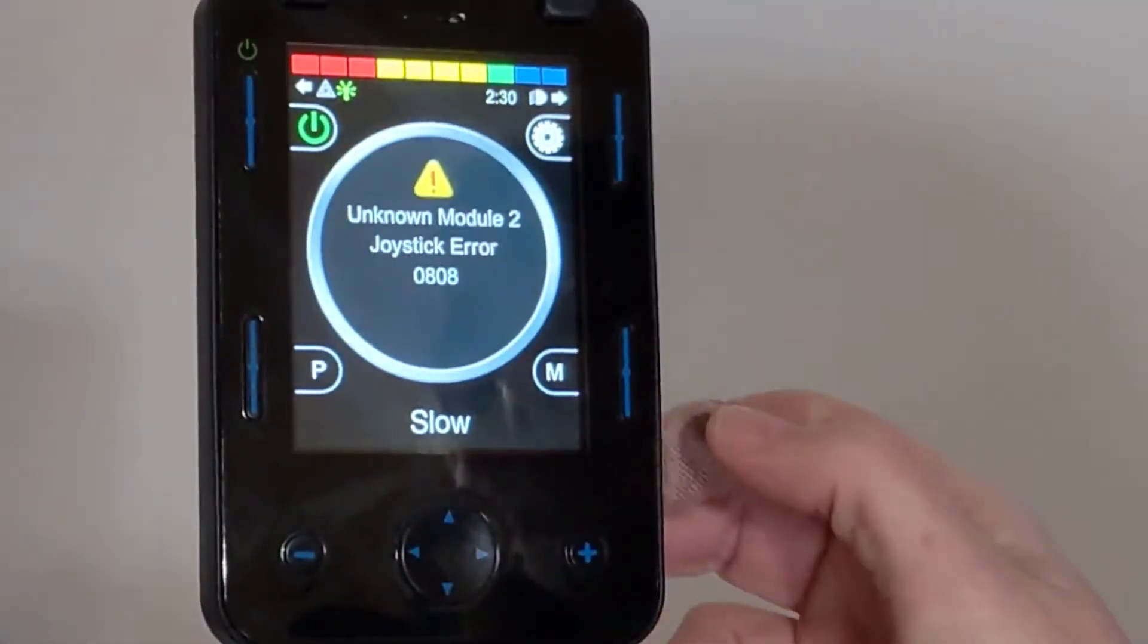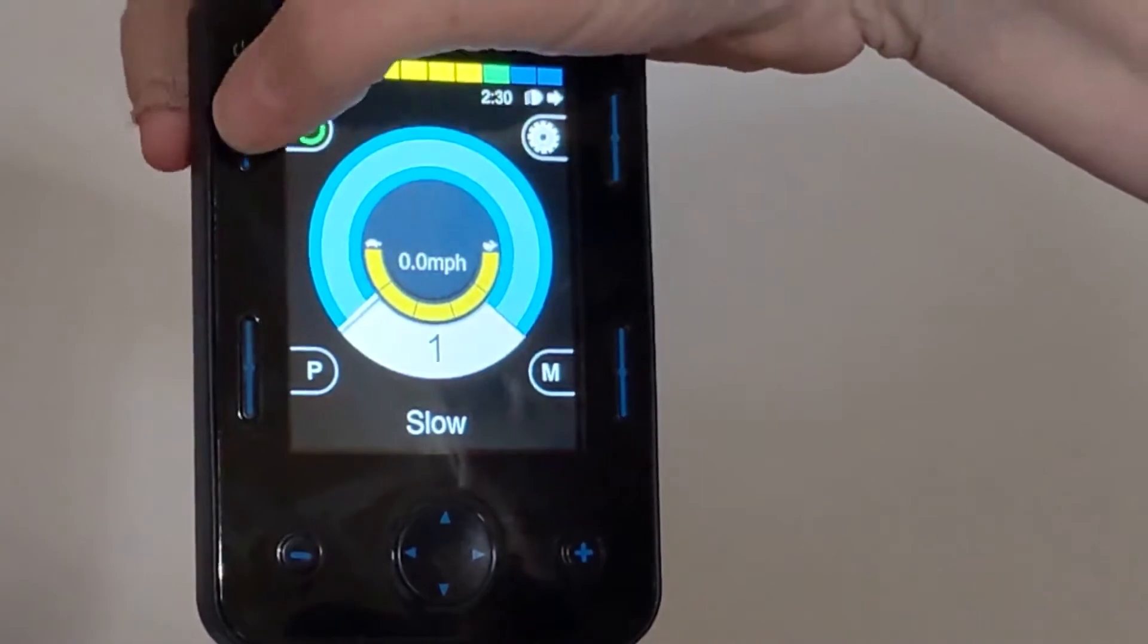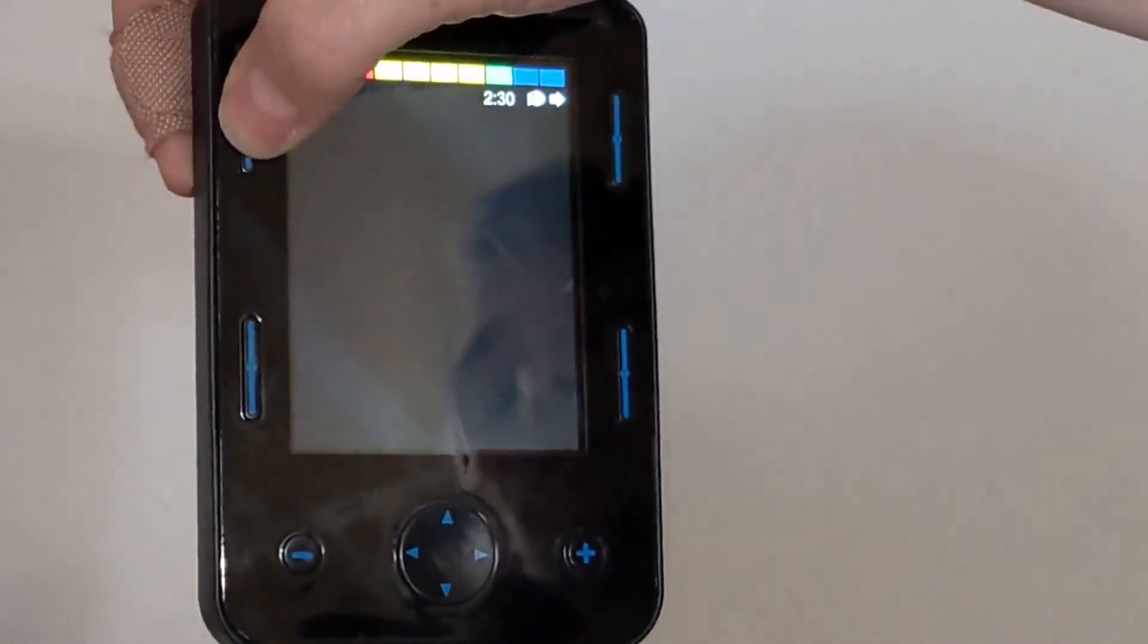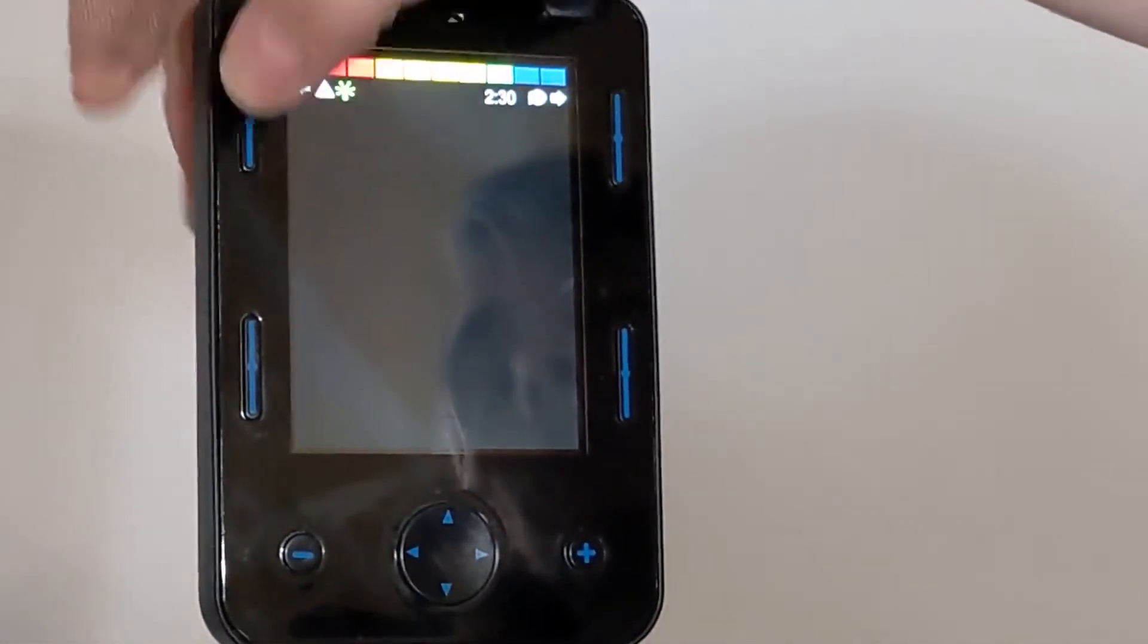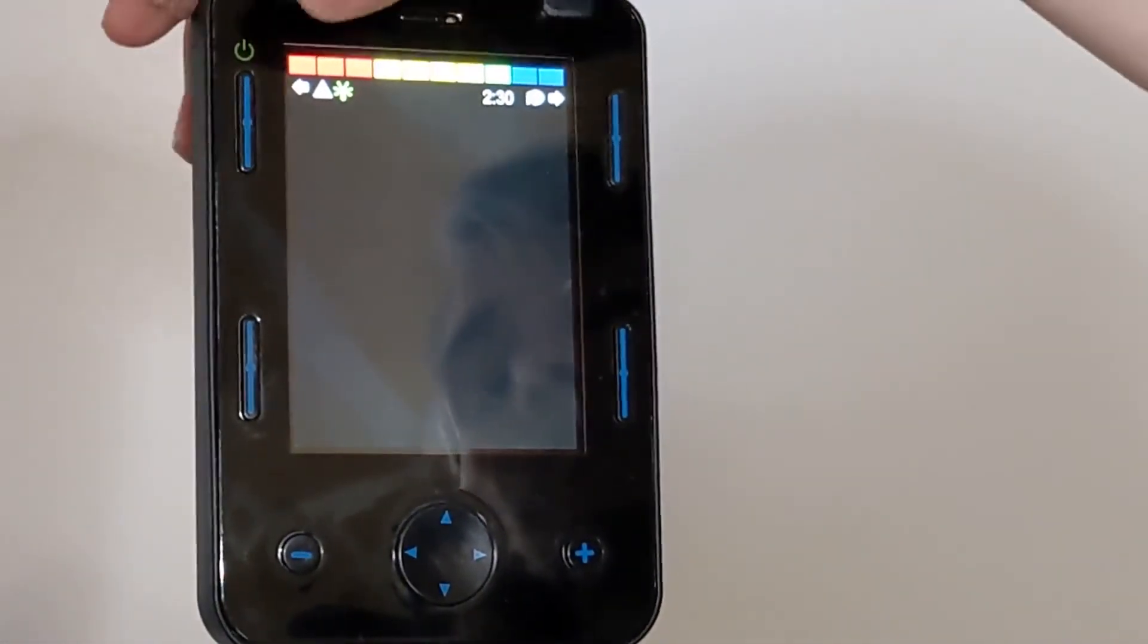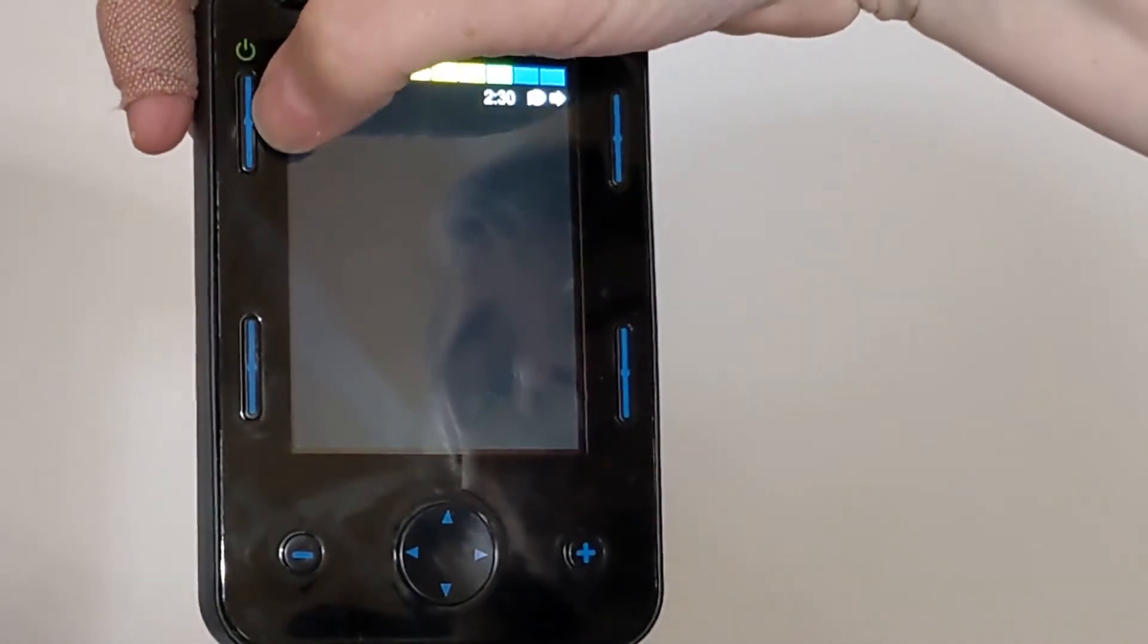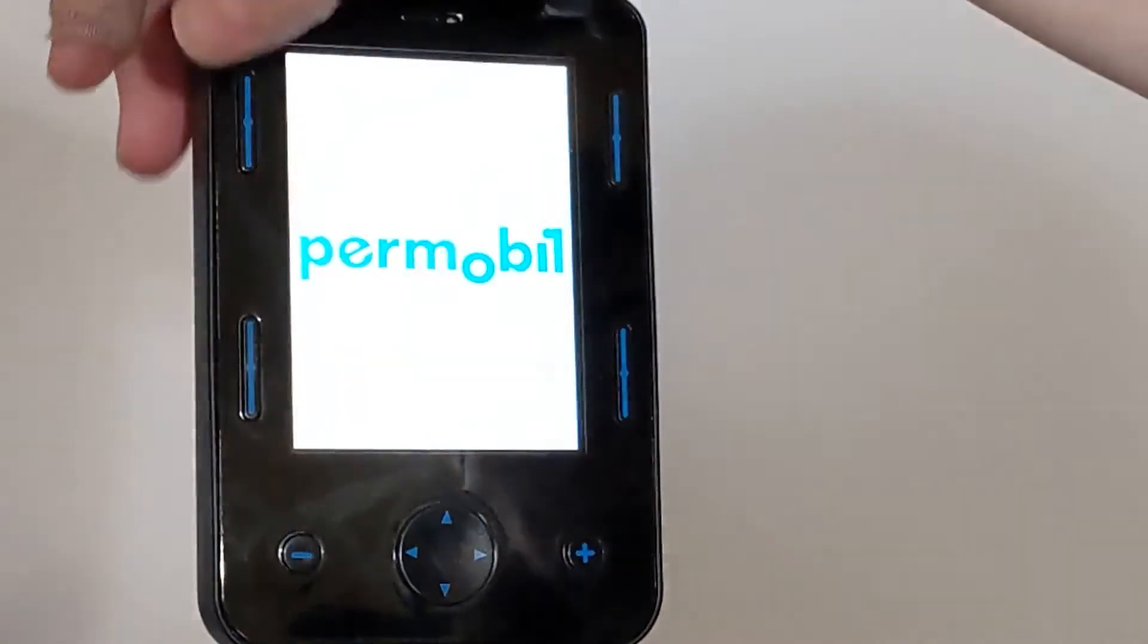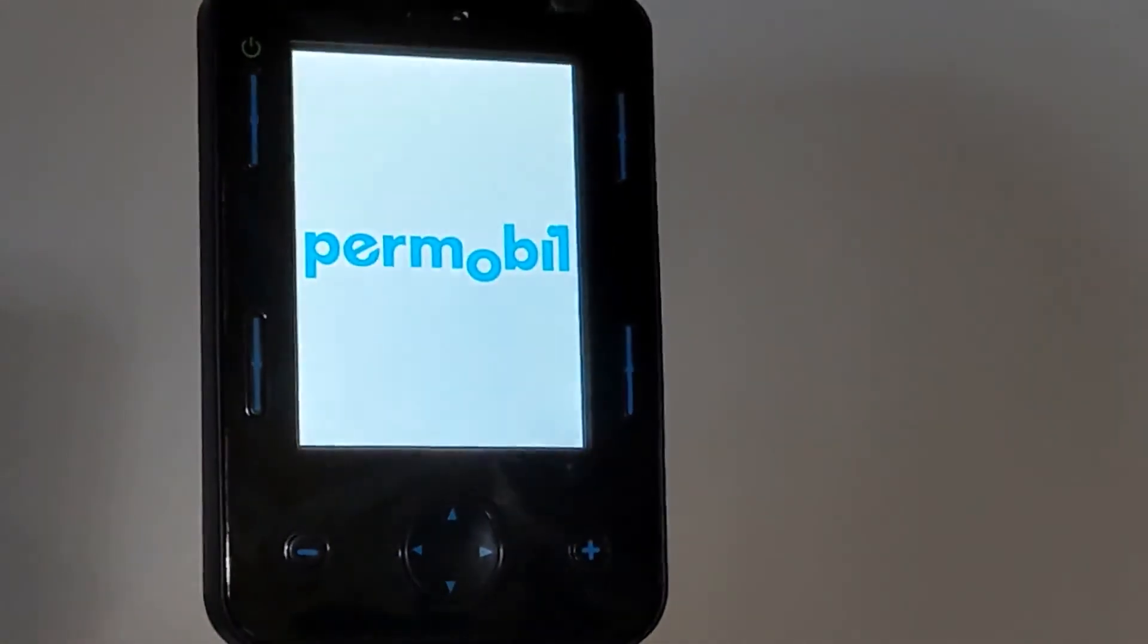And you should be configured at this point. Now we're going to power it off. Go ahead and power it back on.